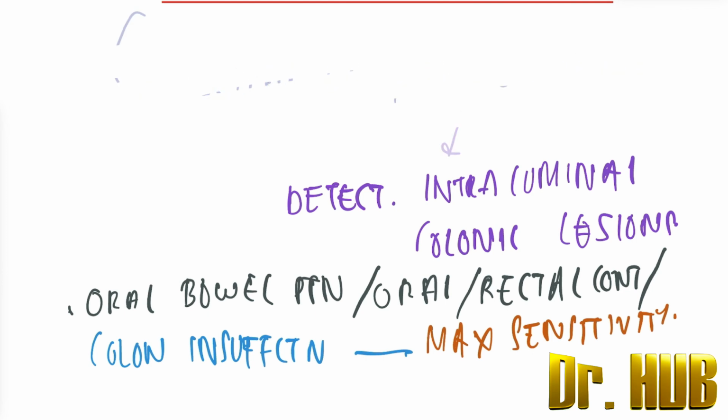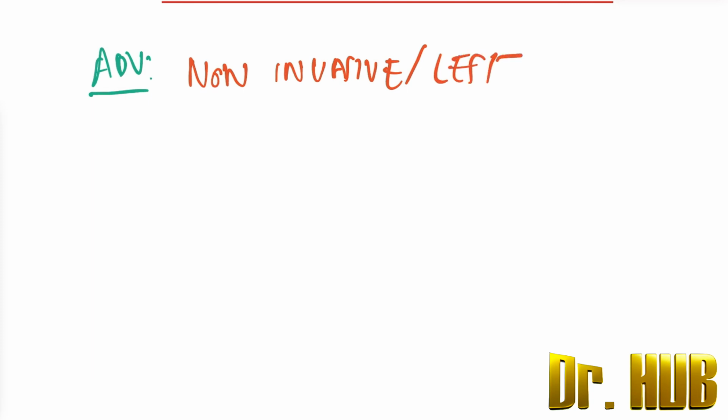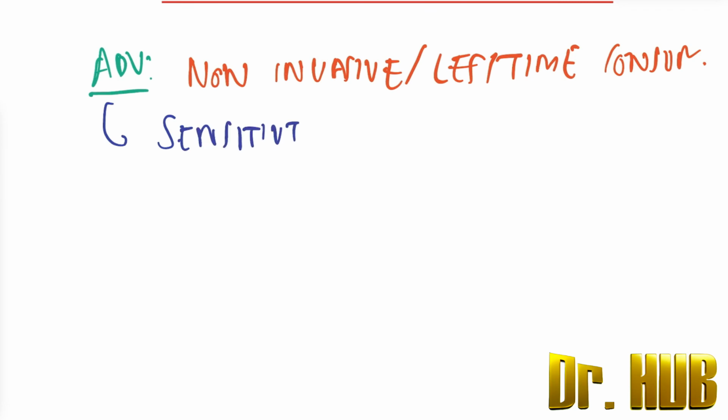So let's look at the advantages here. The advantage here is it is non-invasive and less time consuming. And the other advantage is that the sensitivity may be as good as colonoscopy.